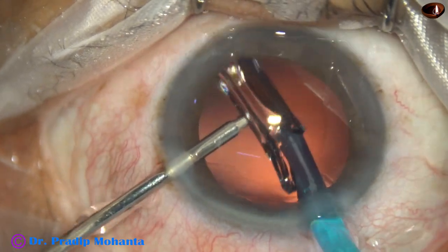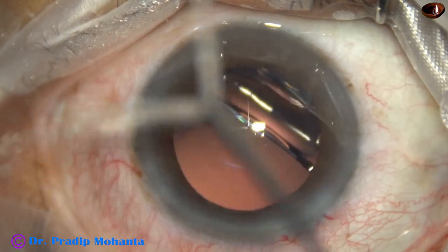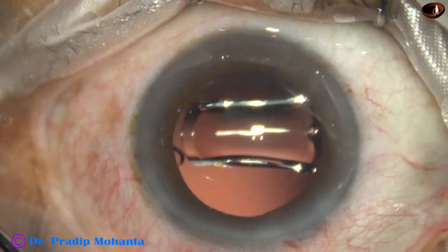This is the Hoya Nanex intraocular lens — it is a beautiful delivery system. Hydro-implantation can be done because this is a straight push delivery system.